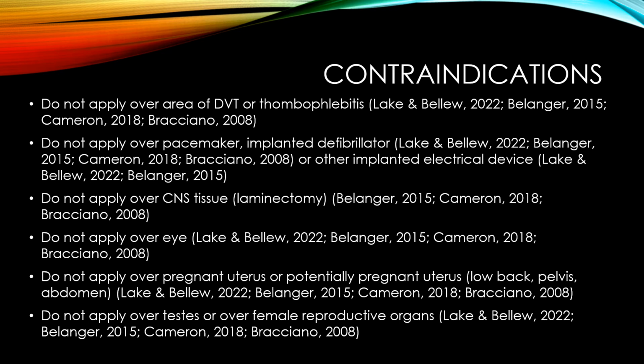Do not apply therapeutic ultrasound over a pacemaker, implanted defibrillator, or any other implanted electrical device, as it could interfere with the function of that.